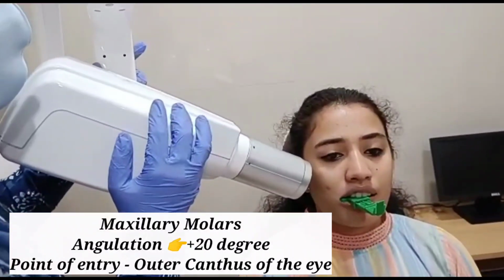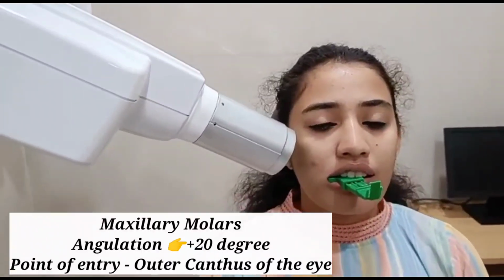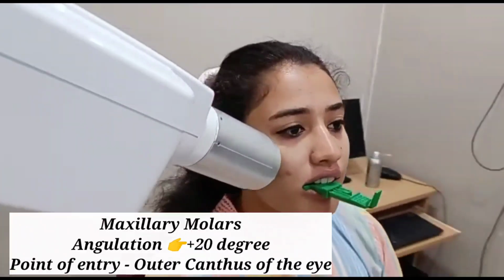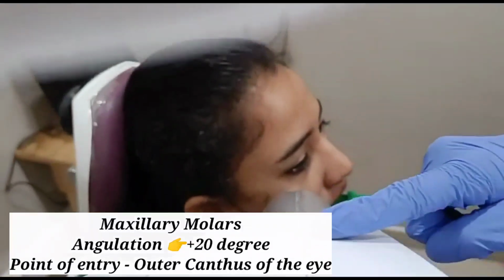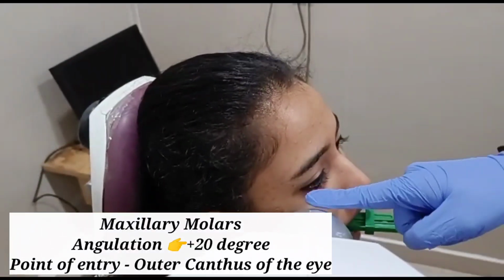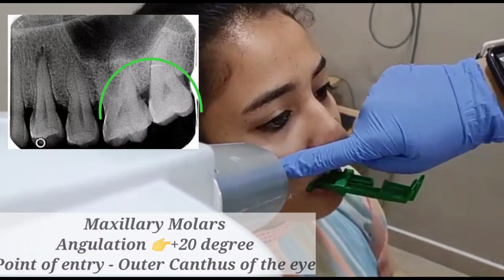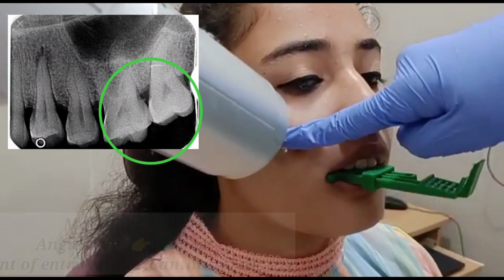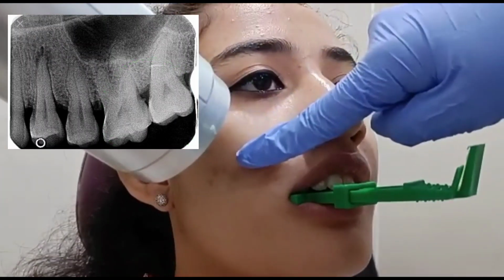So the point of entry is almost at the outer canthus of the eye. You can see here that I am placing the point of entry for the X-ray tube head through the outer canthus of the eye. The central ray will be directed here. So now we are done with the maxillary molar projection.